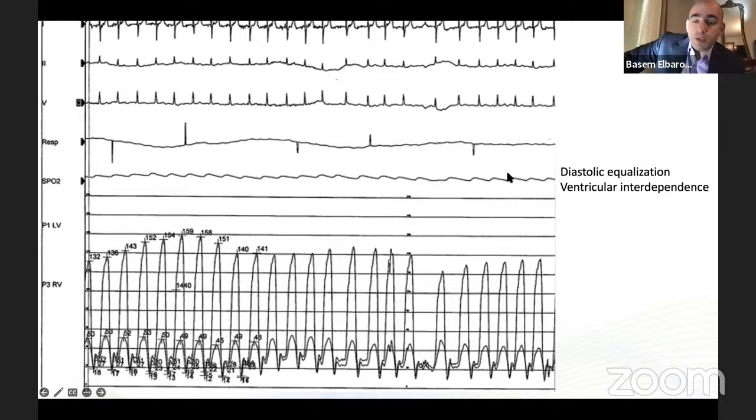But in a normal circulation without any shunts, the mixed venous is the same as the pulmonary artery. So you take a sample from the pulmonary artery and you've got your mixed venous.